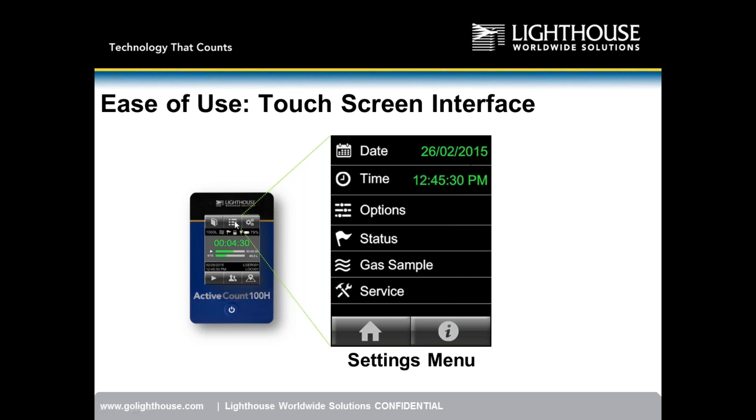The settings menu — represented by the three lines and three dots icon — allows you to change date and time, go into options to adjust beep loudness and screen brightness, view overall instrument status, access gas sampling mode, or enter the service screen which is password protected for calibration. The home button returns to the home screen; the information button shows serial number, calibration date, and firmware version.